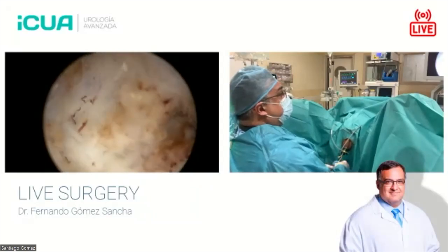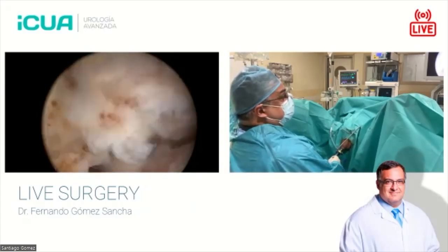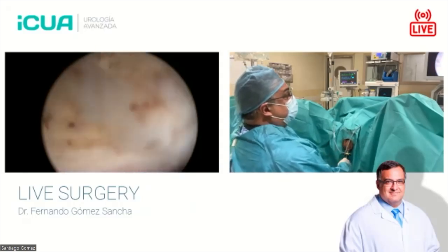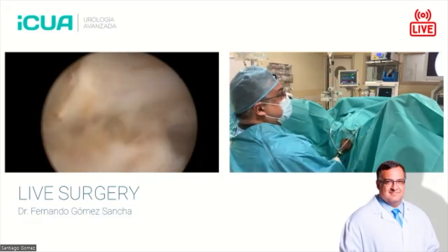I don't see very well. Let's see if I can focus better. Yeah. And then I will try to construct the anterior line. The anterior line takes more effort to construct. Here you see, I see a nice round line.